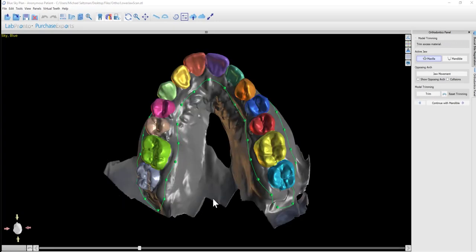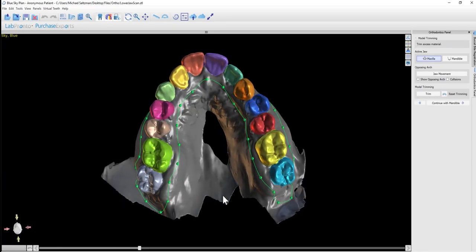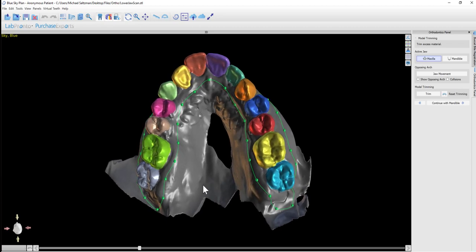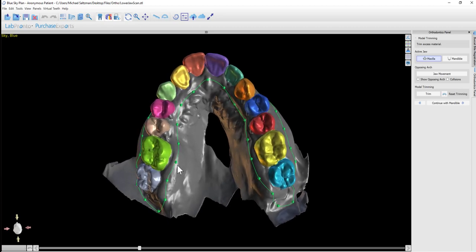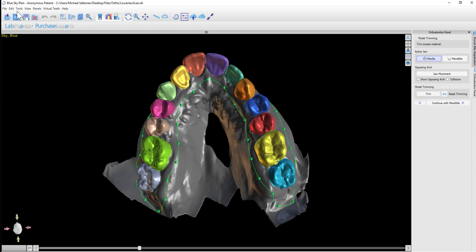The software creates a trim curve with a point below each tooth. By default, it's set to 3mm, but that's an option we can change.